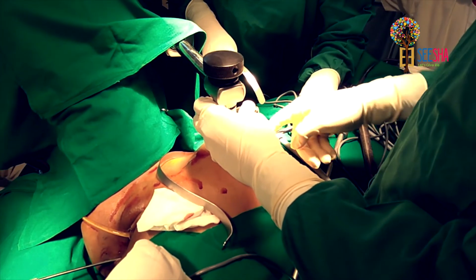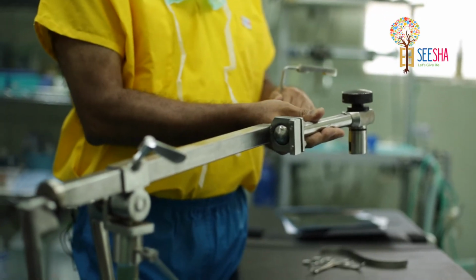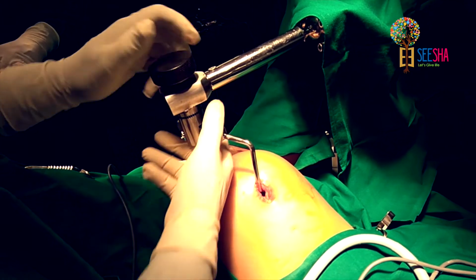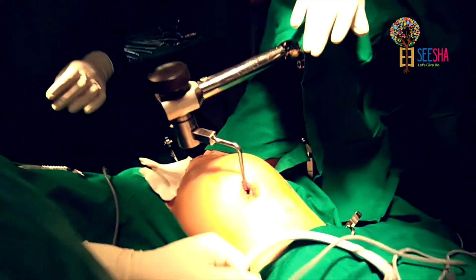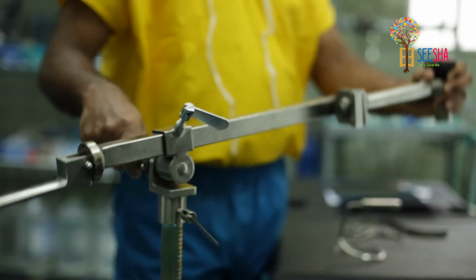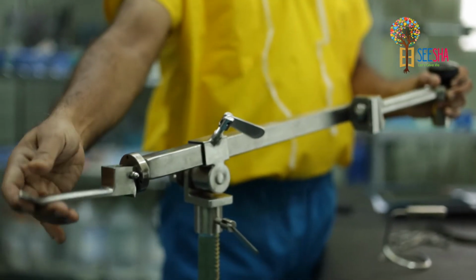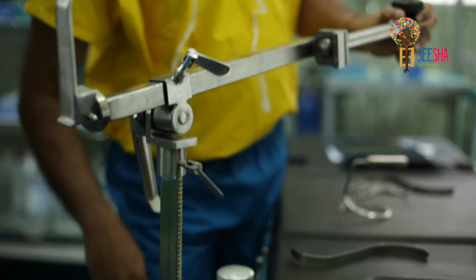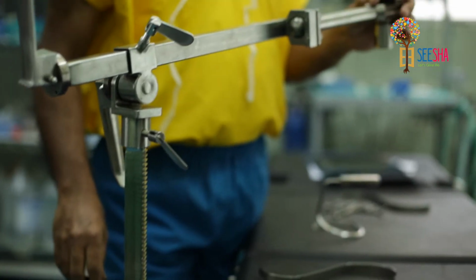Once the abdominal wall is lifted, this is the portion that is used for keeping it in position. It has a ball and socket joint which allows a lot of movement, and also there are just 2 levers which can be used to keep the lift in whichever position is desirable. And locking is very simple, just the use of these 2 levers, and the abdominal wall can be further lifted if necessary.